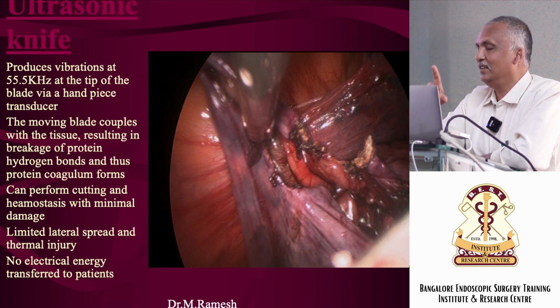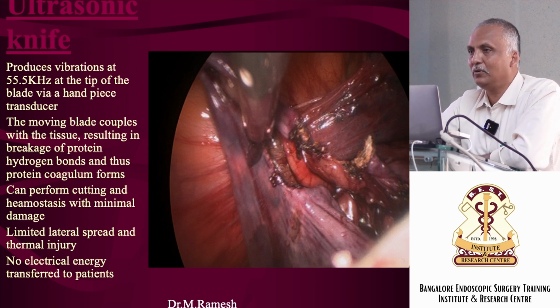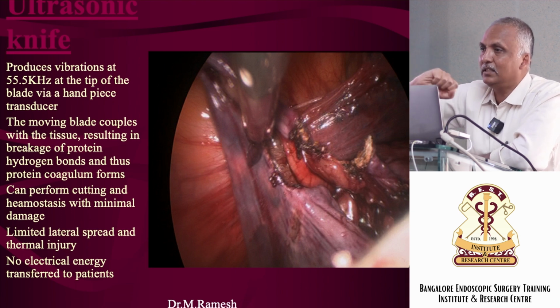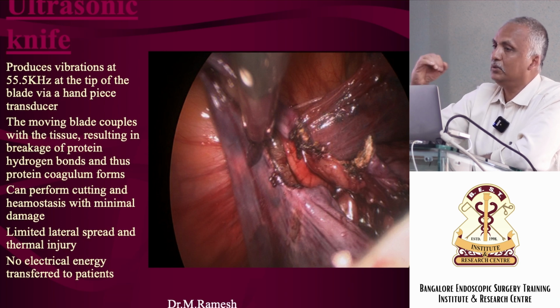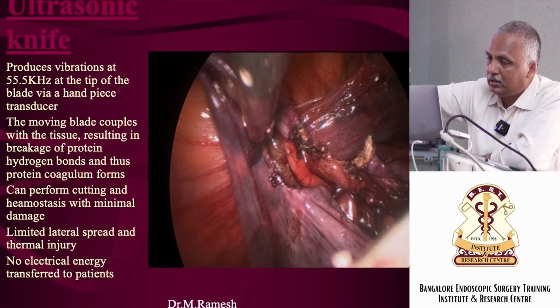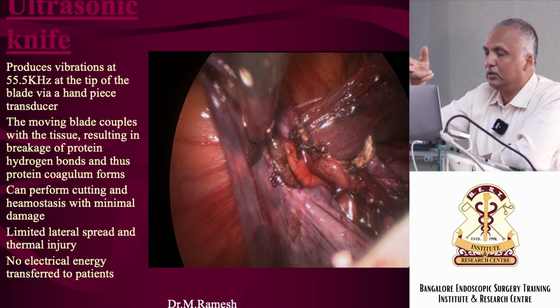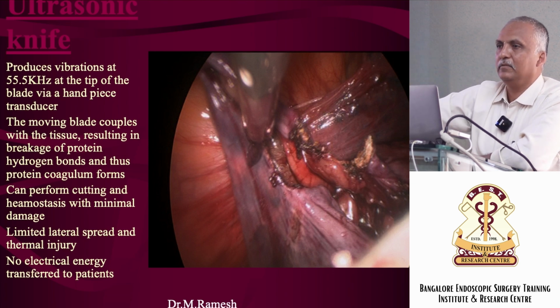But after you finish it, you take out, your instrument is cold. Bipolar instrument is very cold. Tissue has become hot because current has gone inside, the cells have rubbed each other and they have become hot. You are not sending heat. Here, this instrument is rubbing on the tissue, and so when the tissue is becoming hot, the instrument also is becoming hot. So this hot instrument, you touch something, next you want to retract and then again go, you are causing burn there.